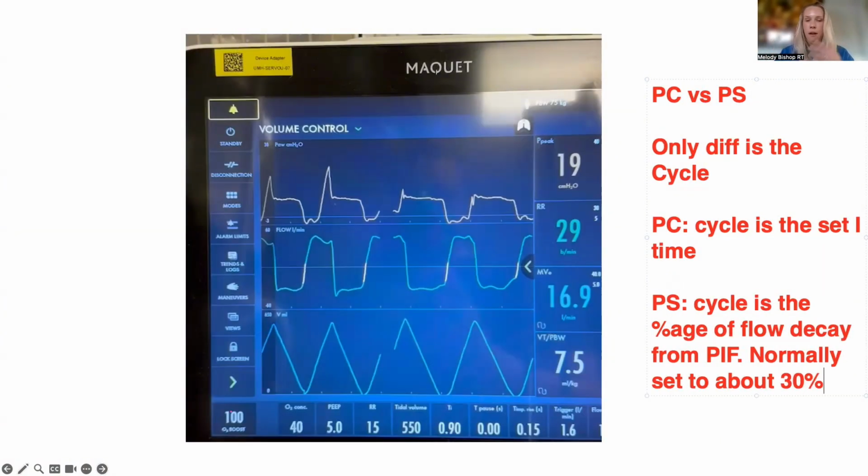And that is a normal physiologic process in our lungs. So pressure support literally tries to be spontaneous by banking on that natural decay that happens in inspiratory flow. And you can think about a patient, if they stop breathing in and they start to try to breathe out, that will naturally also decay the flow. So it's a computer trying to synchronize with a spontaneous breath by banking on normal physiology.